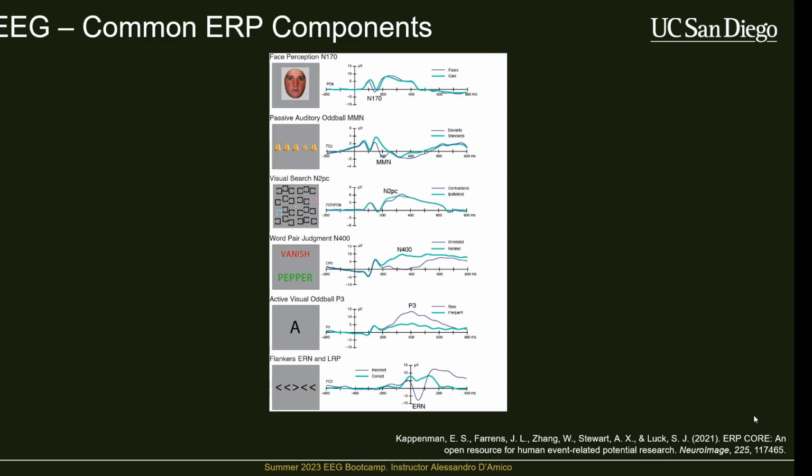It's essentially a standard library of experiment files and analysis files to kickstart any would-be EEG or ERP researcher's field or career. I've implemented the tasks, not in the same program that they use, but using the same parameters. And we're not going to be using their analysis scripts, but we can compare what we've created to their analysis results if we really wanted to. But this is great. Highly recommend reading this paper.